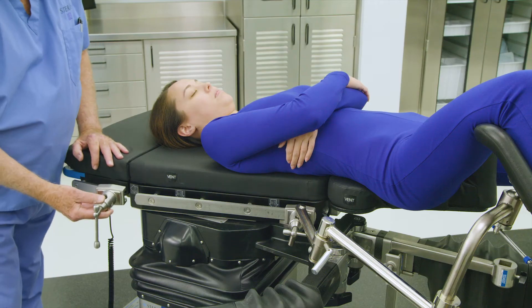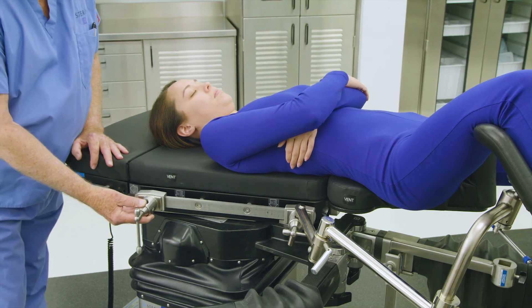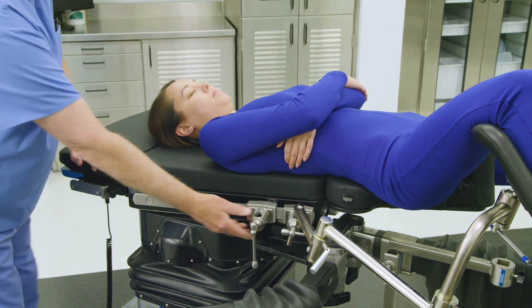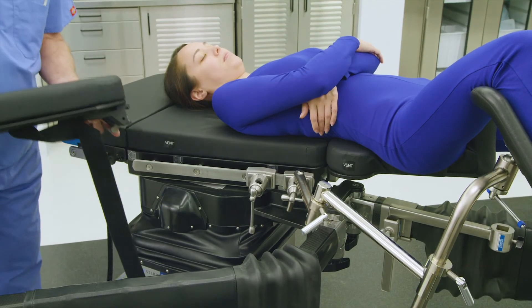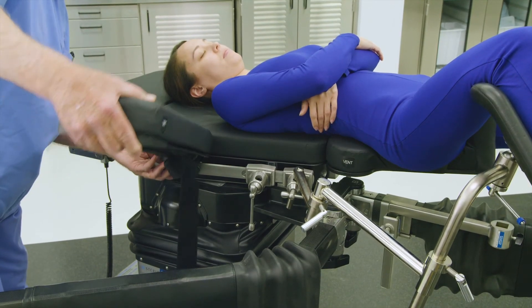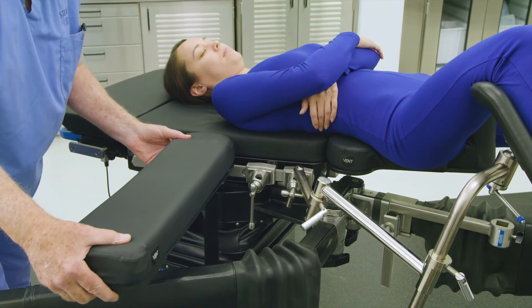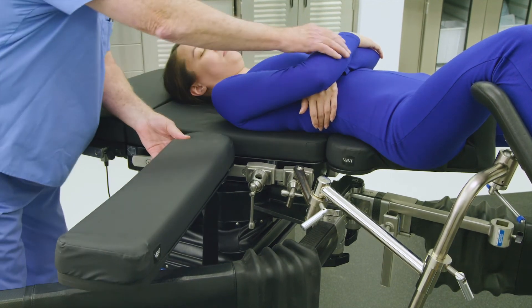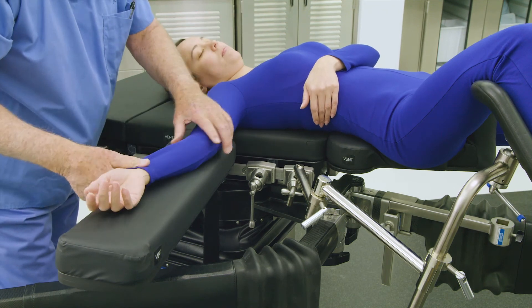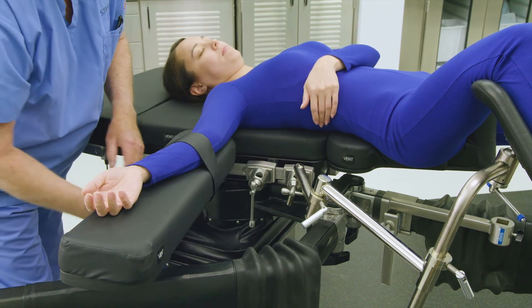Before attaching an anesthesia armboard, first apply a socket clamp to the side rail on the non-operative side of the table. Next, apply the standard anesthesia armboard to the side rail of the table on the non-operative side. Adjust as needed to accommodate proper arm position, and apply the safety strap to secure the arm.